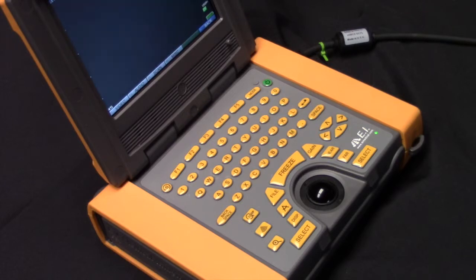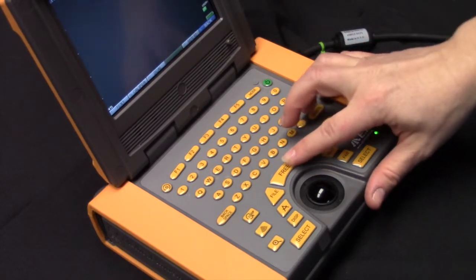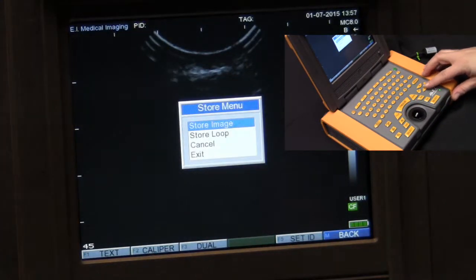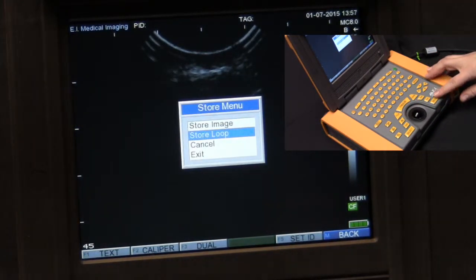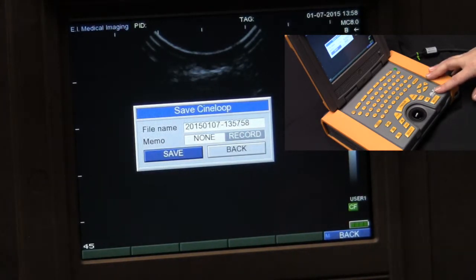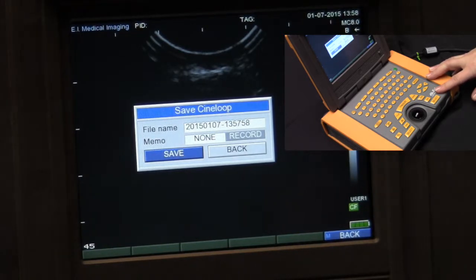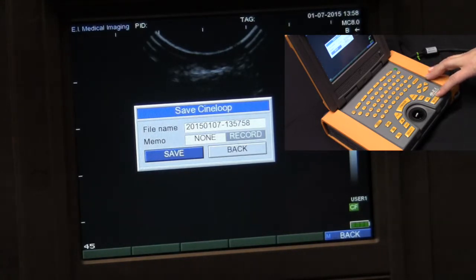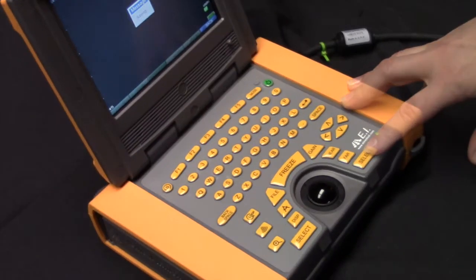To save a video loop to your IBEX ultrasound, press the freeze key. Press the file key and select store loop with your arrow key. Press select, and your save Cineloop menu will appear. The default file name is a time date stamp, which can be typed over if you wish. Otherwise, you can scroll down to the save key with your arrows and press select.